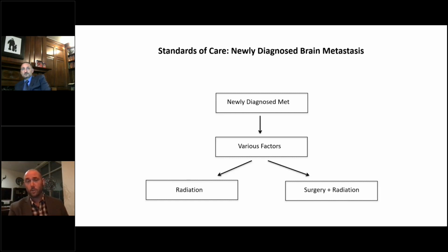So I would say stay tuned. But I would say that I have had some patients where I did the laser right in the motor area and they woke up stronger than when they went to sleep. And I've had the opposite happen as well. And so I am cautious in those eloquent areas where we're right up against it, and I'm less willing to take that blue line right to the edge there. I try to be a little bit more conservative there to prevent that kind of a deficit.